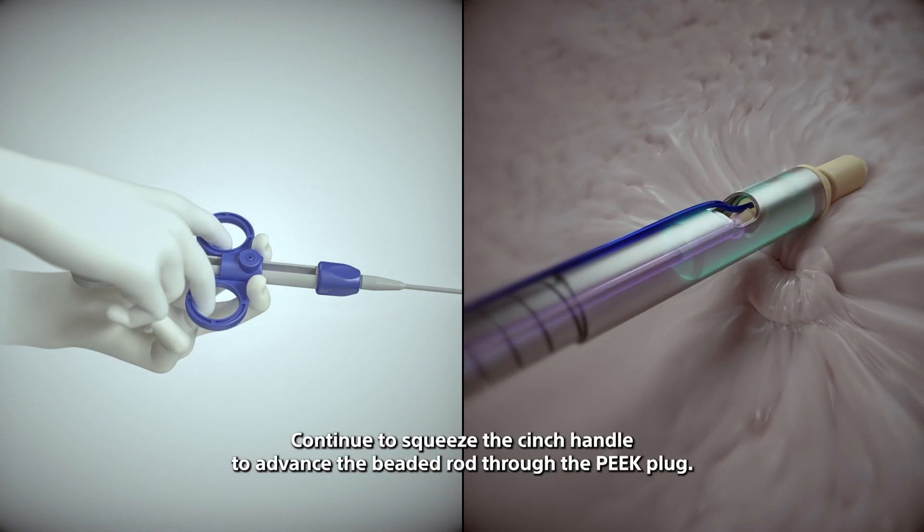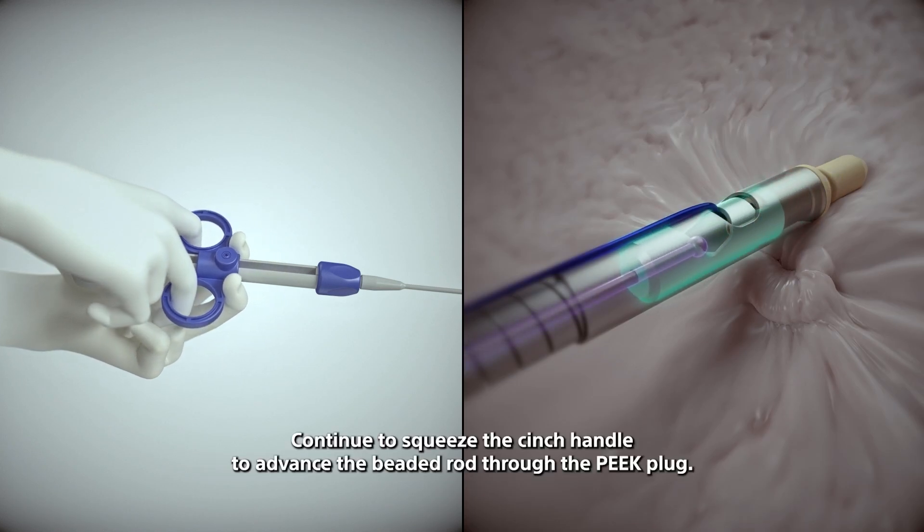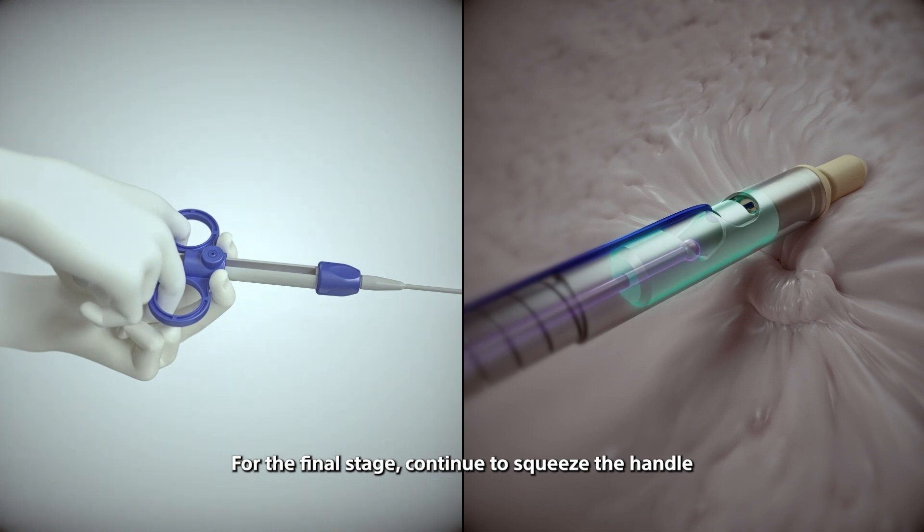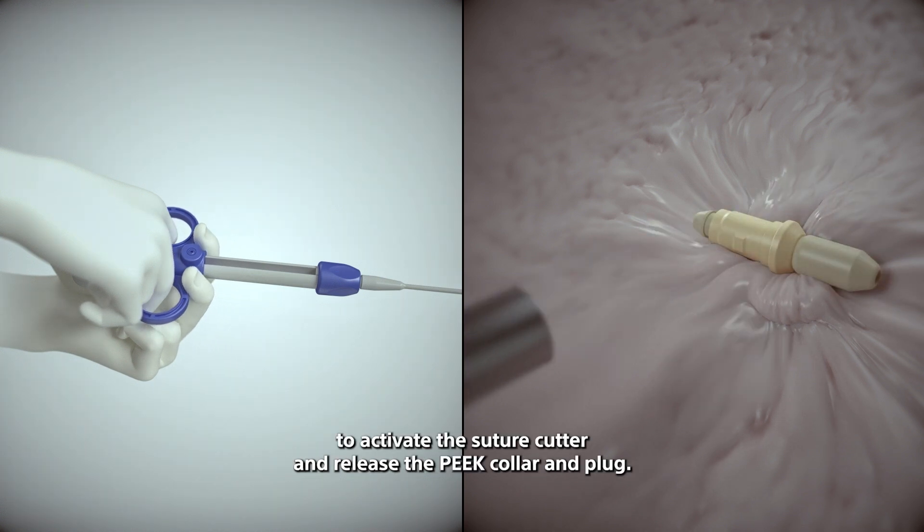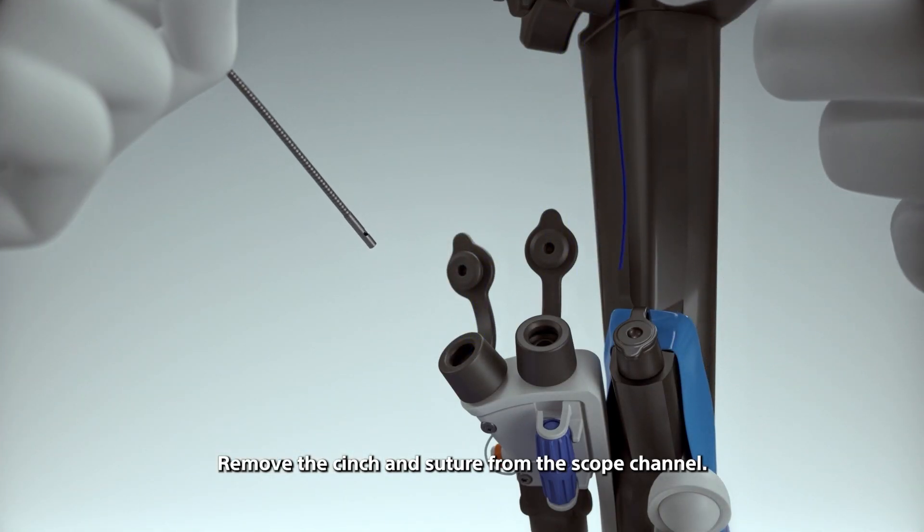For the final stage, continue to squeeze the handle to activate the suture cutter and release the peak collar and plug. Remove the cinch and suture from the scope channel.